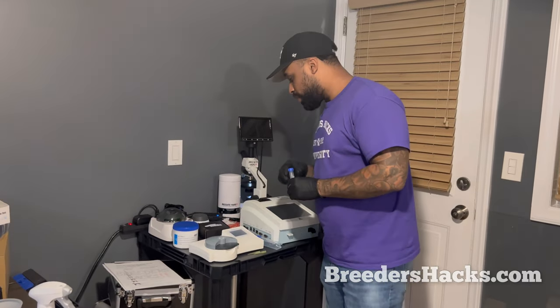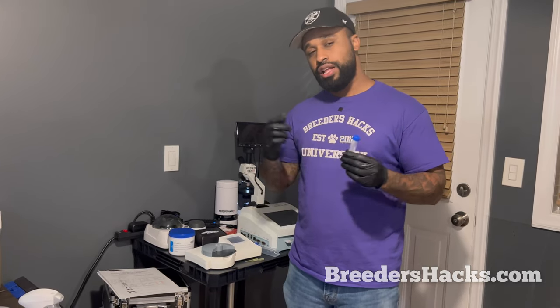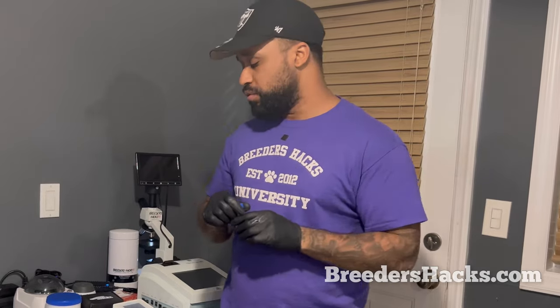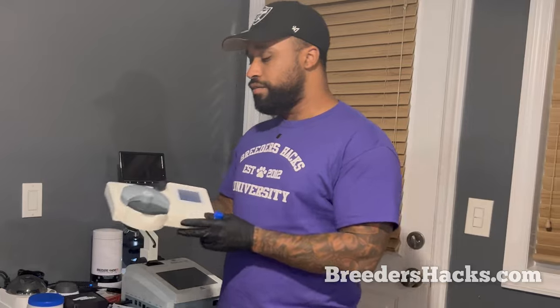So you're gonna wanna work quickly. It all depends. If you're using the semen just for an evaluation, that's one thing. If you have a breeding or whatever the case may be, you just wanna take what you need and then keep it moving. So the first thing you're gonna wanna do is take your photometer, right?